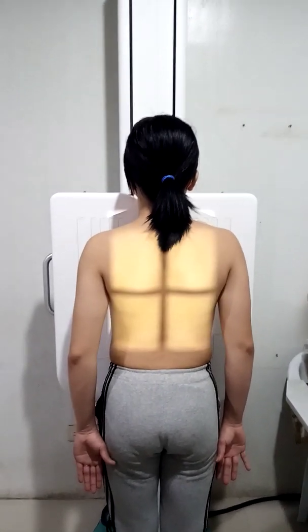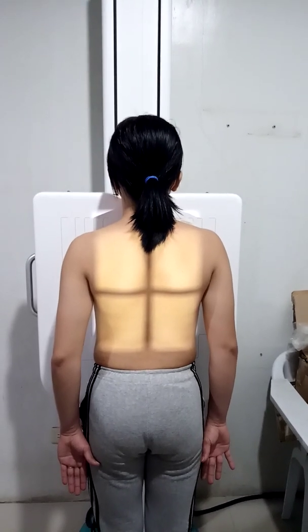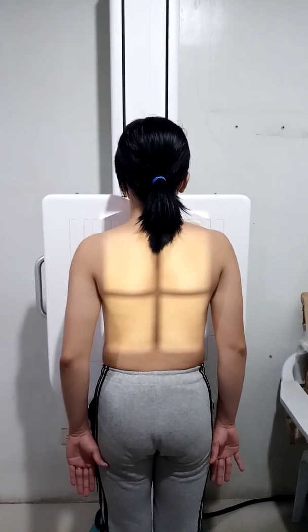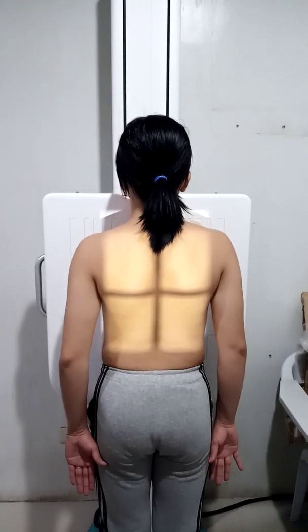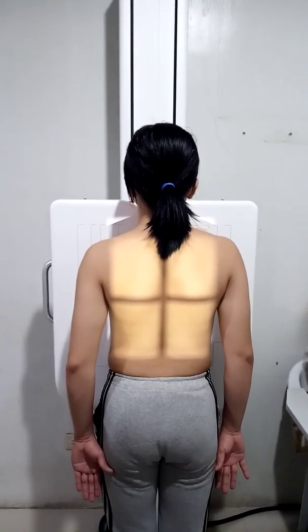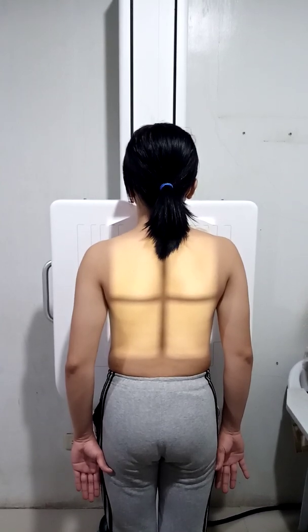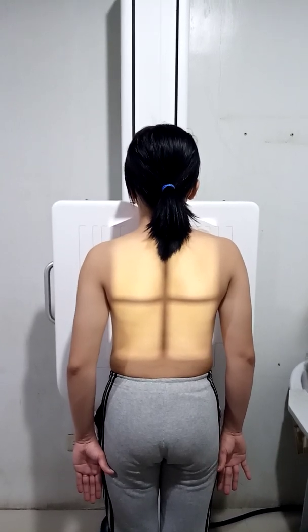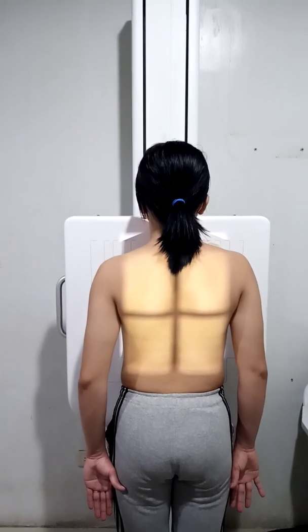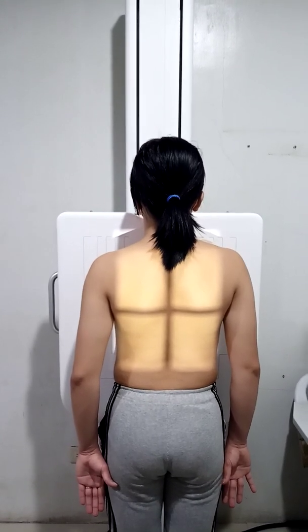So in patient positioning, there should be no rotation. Then the lateral rib margins should be an equal distance from the vertebral column. Then in exposure, there should be no motion and sharp bony margins. Contrast and intensity appropriate to visualize ribs 1 to 10 above the diaphragm and 10 to 12 at minimum below the diaphragm.